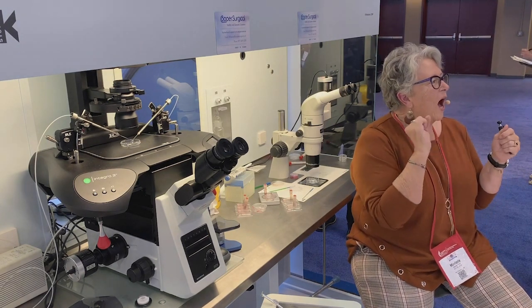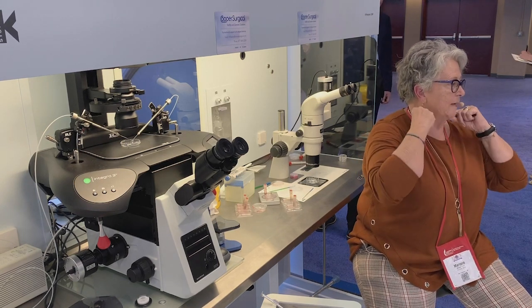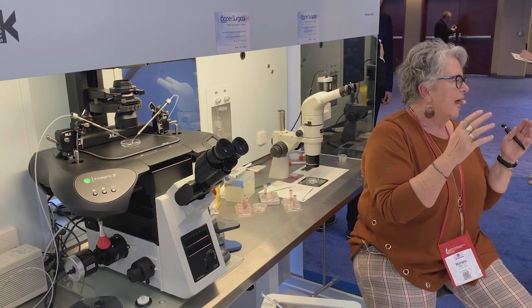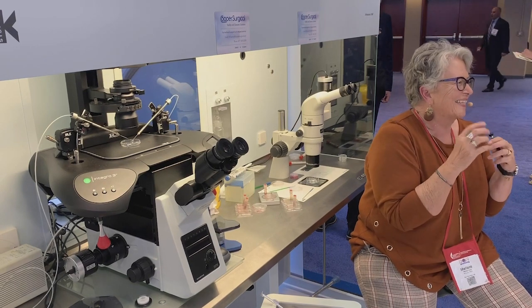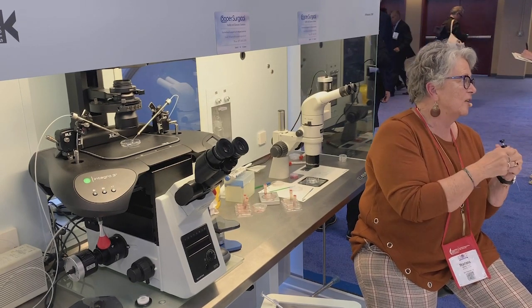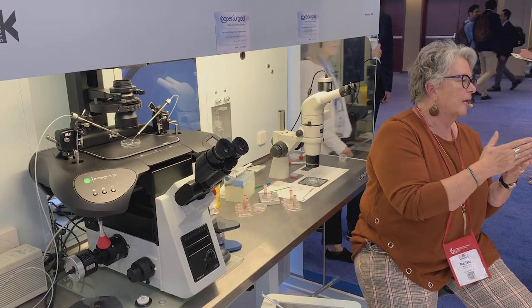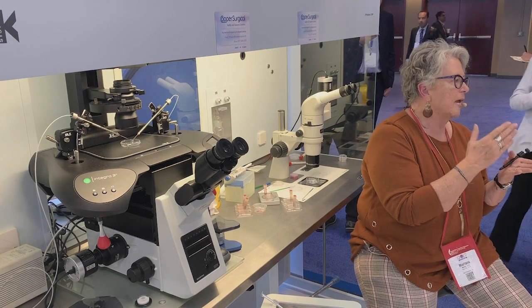So I wanted to make sure that I had a device. Oh, sorry, that gets really loud there, doesn't it? I wanted to make sure I had a device that was as FedEx resistant as I could make it. So we tried to dislodge our samples. You know, I can't do anything if they're going to throw the thing around, but I can at least make sure that the embryos stick to the devices, and they do.